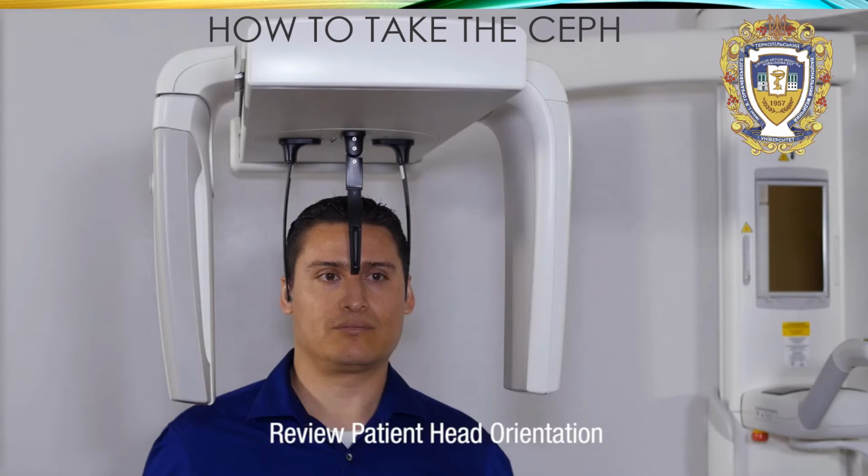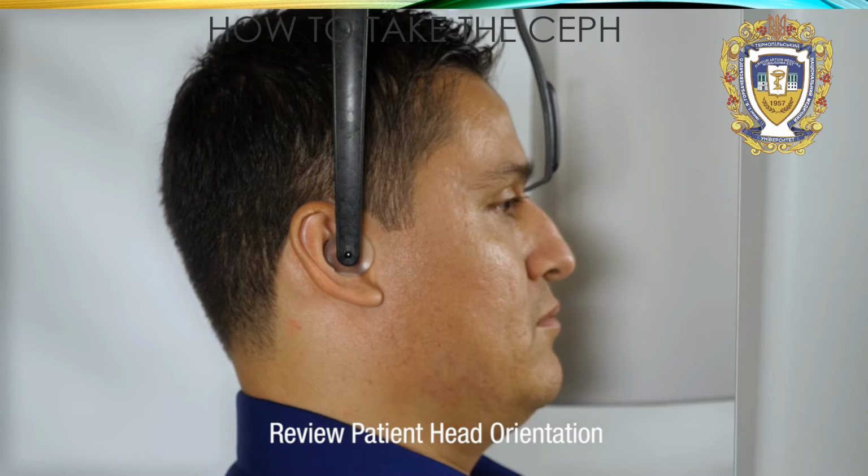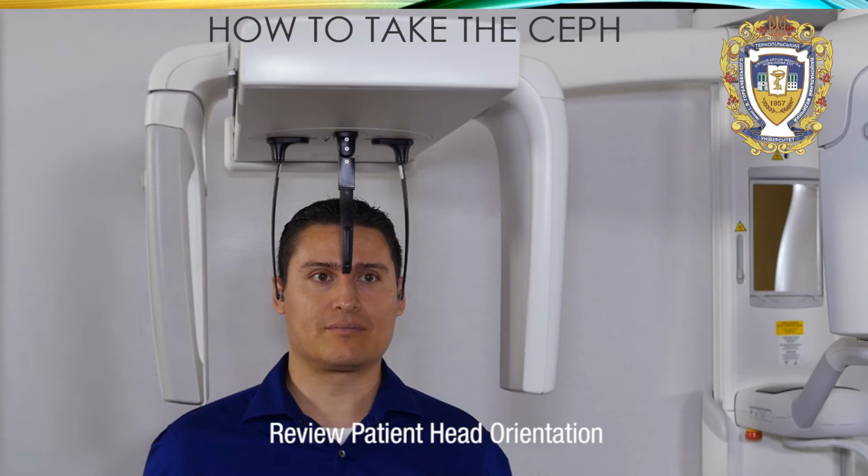The patient's head position should be reviewed to make sure it is correct along 3 axes. From a side lateral view, the Frankfurt plane, bottom of orbit to otic posts, should be level horizontally. From a frontal view, the patient's face should be straight forward without any twisting. Also from the front, ensure the patient's head is not tilted but vertically straight.